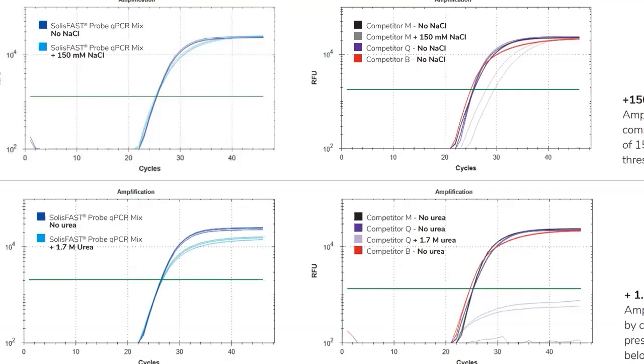And especially in a point-of-care setting, testing urine samples is of high relevance because getting a quick diagnosis for infections like gonorrhea or chlamydia is really important so that the right treatment could be used to stop the infections from spreading.